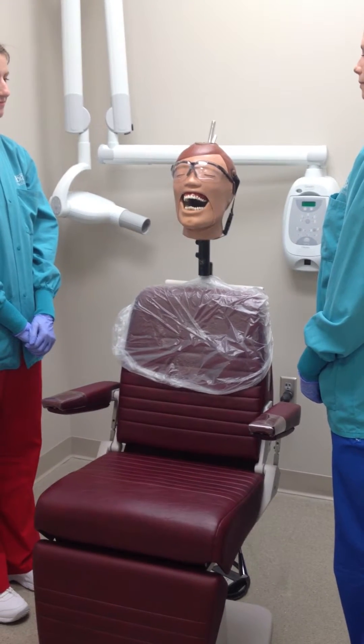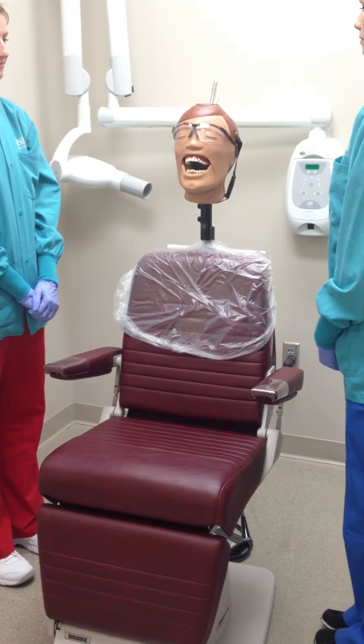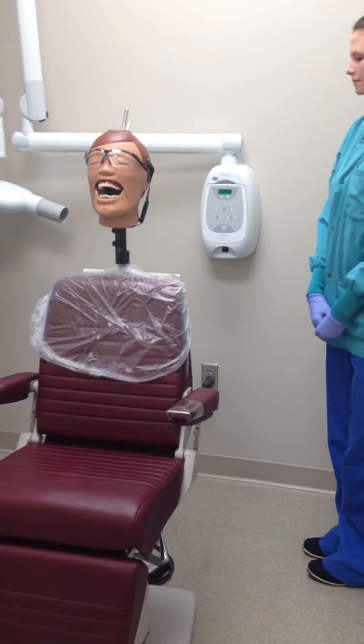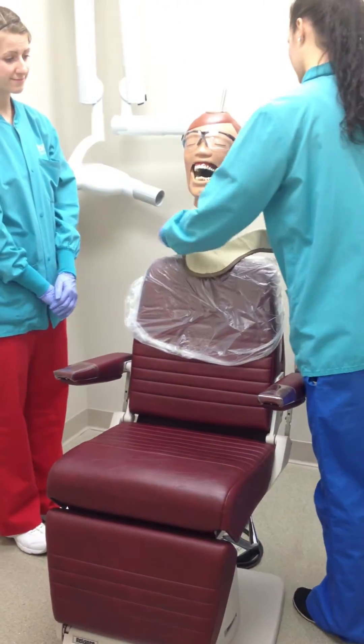Today we are going to show you how to take a mandibular lateral occlusal radiograph. If the x-ray unit is not turned on when arriving to the x-ray unit, then turn it on using the power switch. After setting up and seating the patient, place the thyroid collar around the patient's neck for protection.